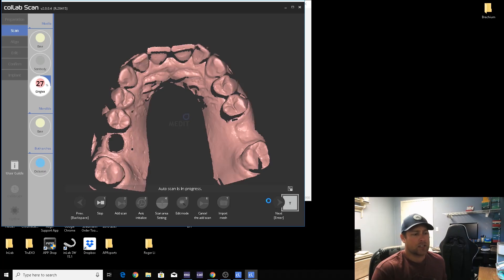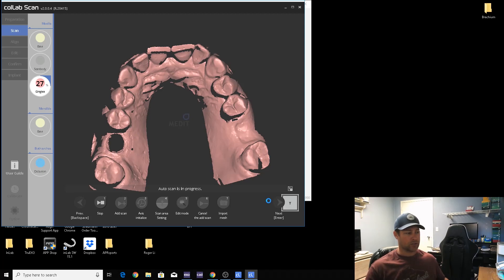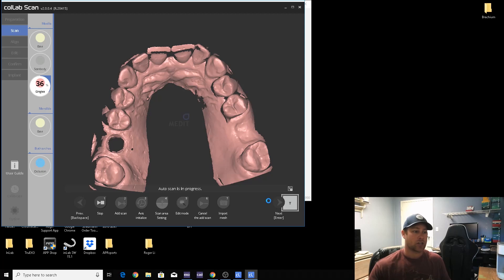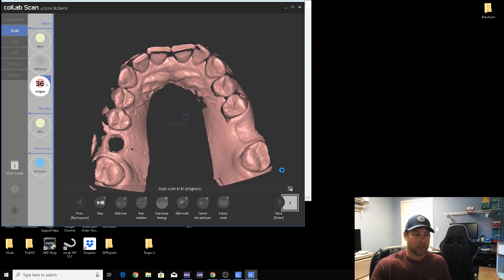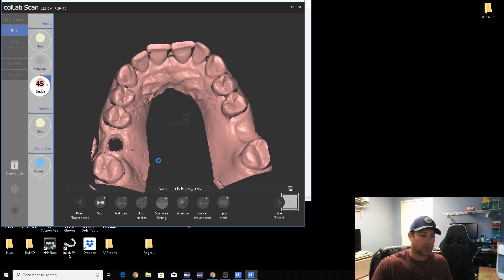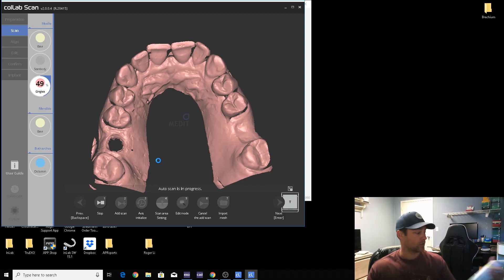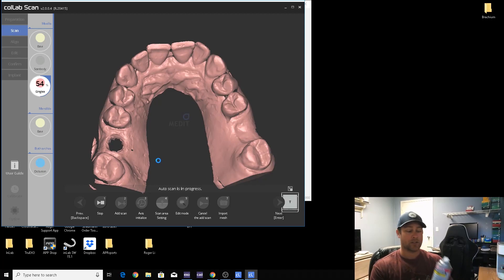You can use scan spray on the gingiva, but 99% of times it's not necessary. The only way you would need to scan it is if the gingiva is really shiny. Scanners don't typically like shiny objects. The light doesn't reflect properly and you won't get a good scan.